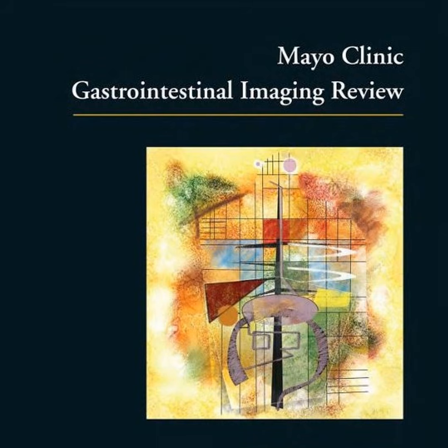And this is exactly where the physical properties of ultrasound become super tricky. Because the surrounding fatty liver is engorged with lipids, it is highly echogenic. Right, it looks bright on the monitor due to the increased acoustic impedance. Yes, but that patch of completely healthy, normal liver tissue has less acoustic impedance, so it appears relatively hypoechoic, or dark by comparison. What does a hypoechoic spot usually mean? It looks exactly like a neoplastic mass hiding in the liver. It's terrifying for a second.